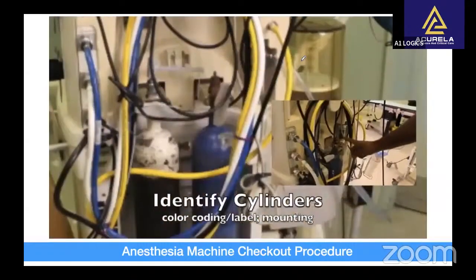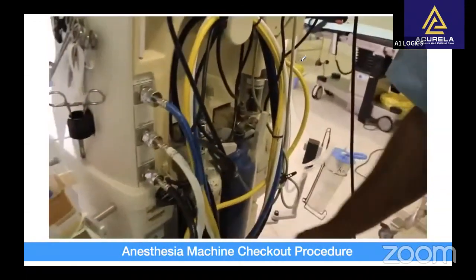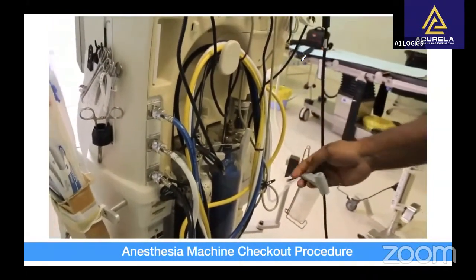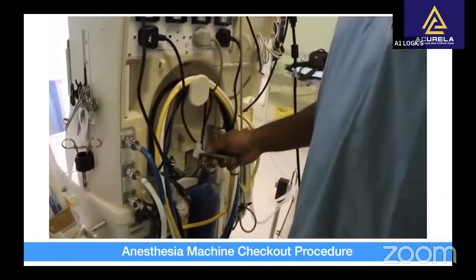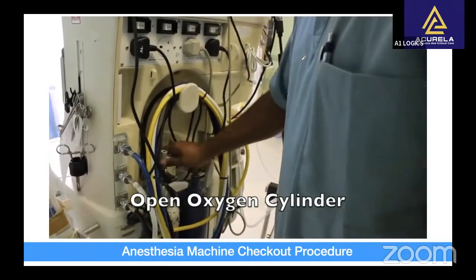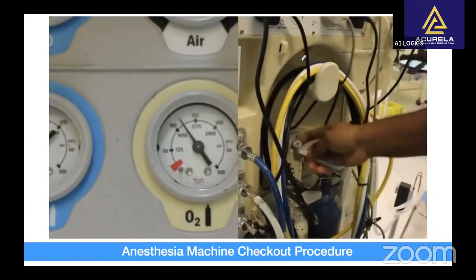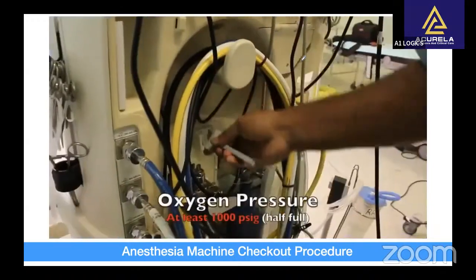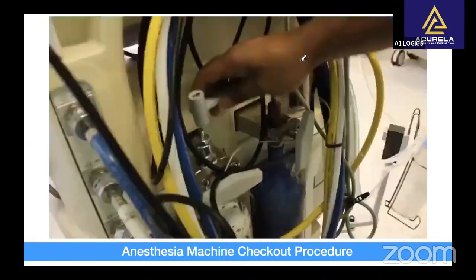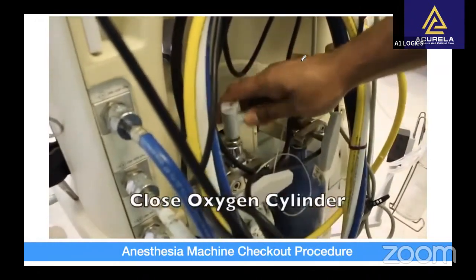Now identify the cylinders by color coding or label and ensure proper mounting. All the cylinders should be in off position. Regarding oxygen cylinder, you need to open the oxygen cylinder. See that the cylinder pressure gauge reads at least half full or 1000 psig after opening the cylinder. After that, keep the oxygen cylinder closed.